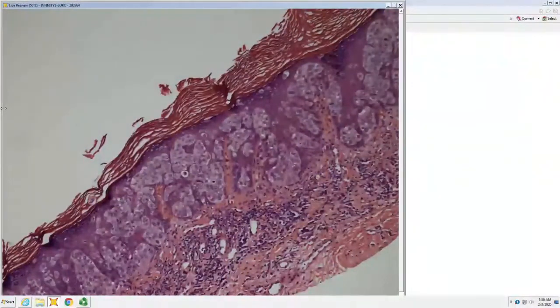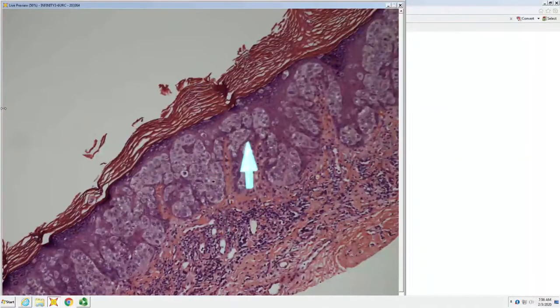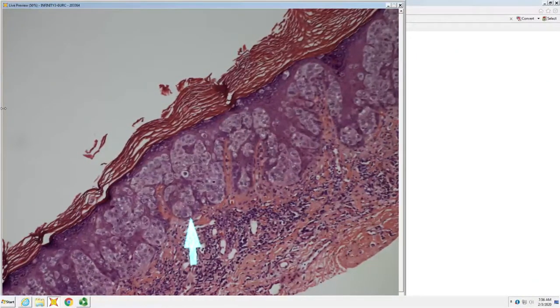There's an interface dermatitis, and there are all these big clear cells in the epidermis, well, clearer cells in the epidermis, with a blue-gray cytoplasm. Okay. And do they sit at the DE junction, or do they crush the basal layer? The basal layer is crushed. So what is it? I think the basal layer looks like it's crushed. Your diagnosis?